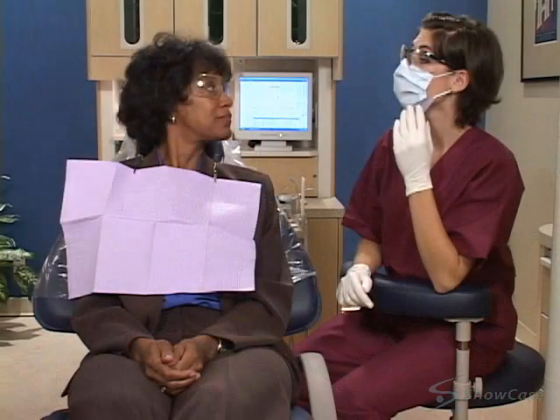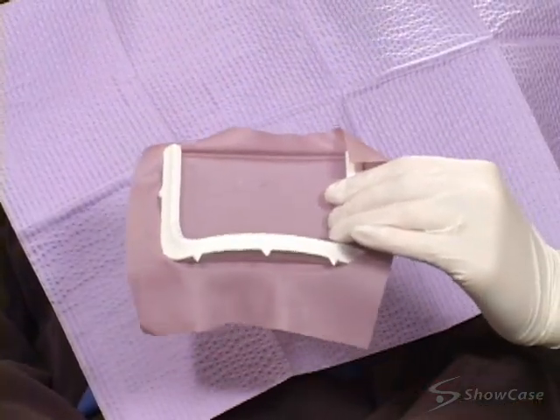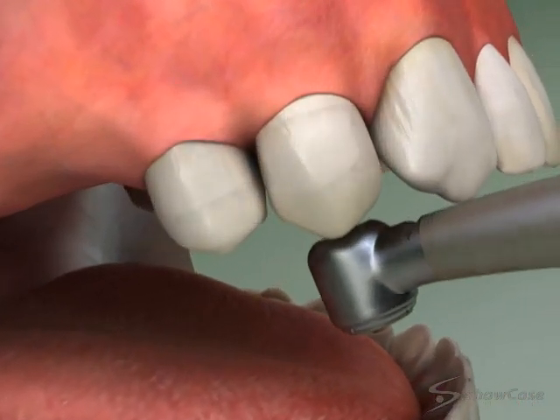On your first visit, we numb the area to make you comfortable. We may also use a rubber dam to protect your mouth while we work. We remove any decay and use the handpiece to shape the teeth that will support the bridge.